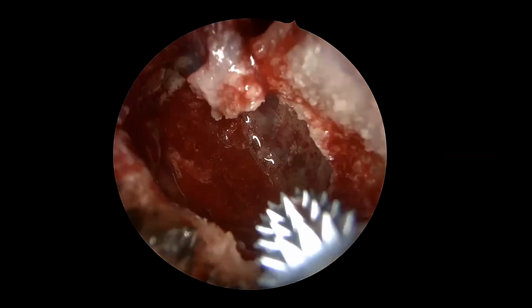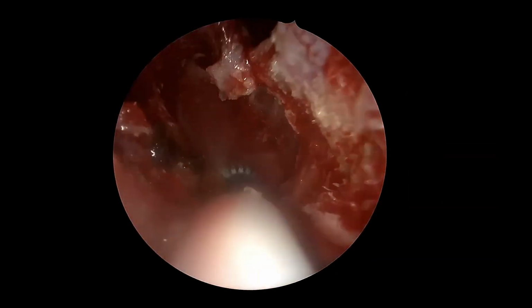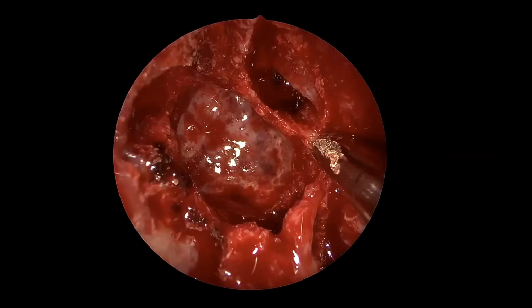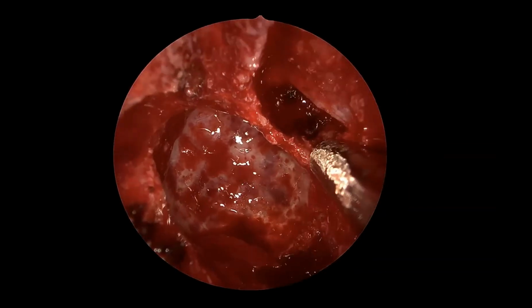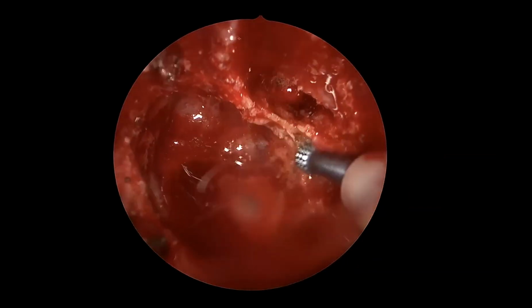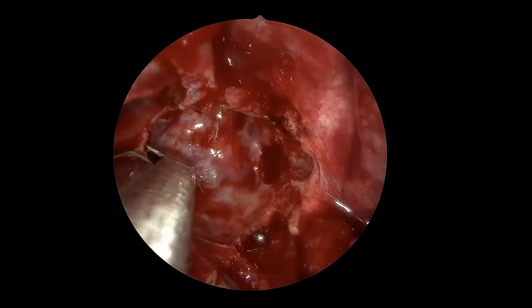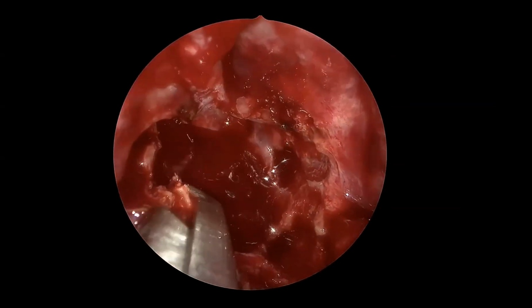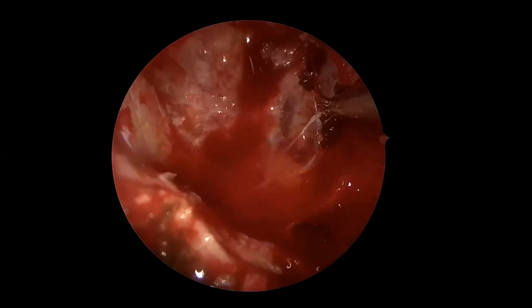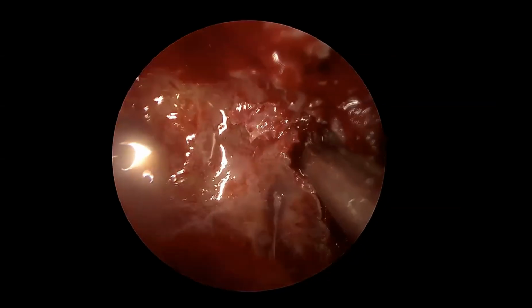Her bone was really thick, so I actually used the Sonopet much earlier to drill down the posterior, the perpendicular plate of the ethmoid bone, which is part of the septum, before I started the sphenoid rostrum. And then you see me here drilling down some of that inner sinus septum and opening up the anterior wall of the sphenoid sinus a little bit more in preparation for surgery.